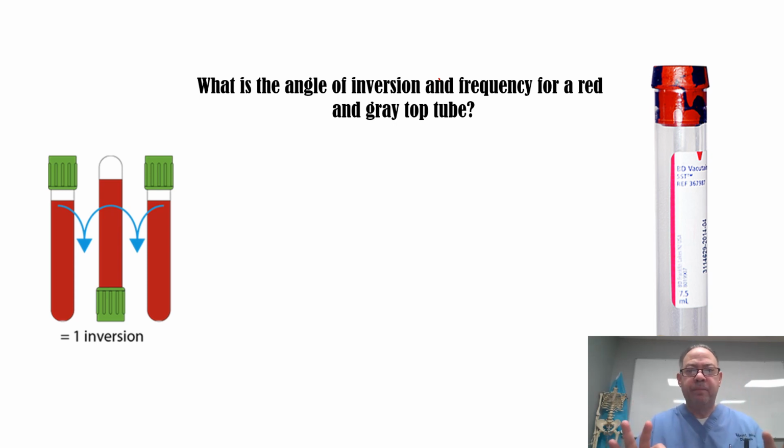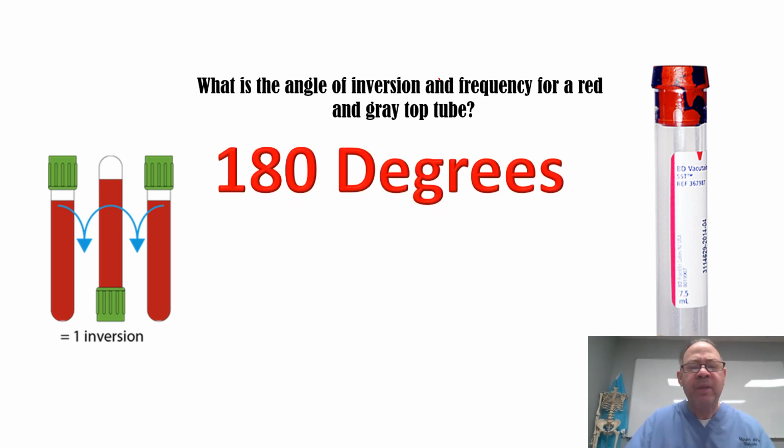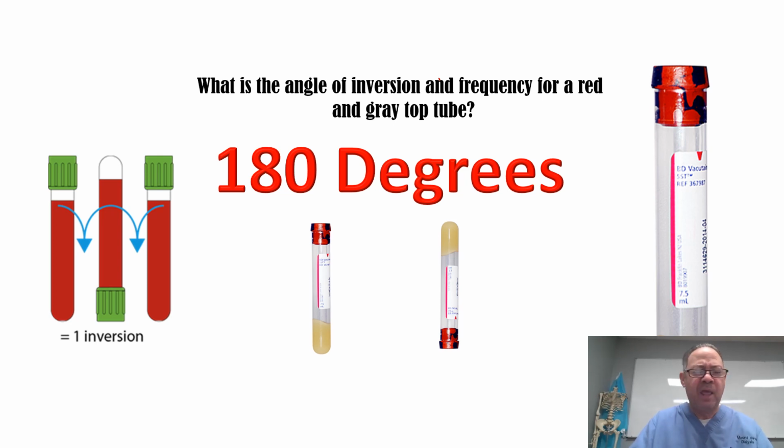Every tube, everyone, without exception, has to be inverted 180 degrees. Sin excepción, todos los tubos tienen que invertirse en 180 grados. Sin excepción. Y recuérdate, and remember, that is 90 plus 90. Okay? That is one inversion.